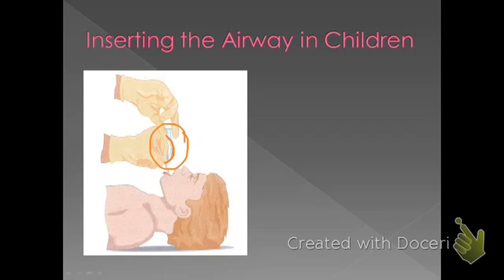So with the airway up in this position, typically what we would want to use is some form of tongue depressor to hold the jaw and the tongue down, and then we would just nicely or slowly insert that airway into the child's airway to remove the tongue from the back of the throat. It's a very simple technique. You might meet some resistance from the mandible and the maxilla, so you might have to actually pry open the jaw if the victim is truly unconscious and has been unconscious for several minutes. But other than that, it should be a smooth insertion.